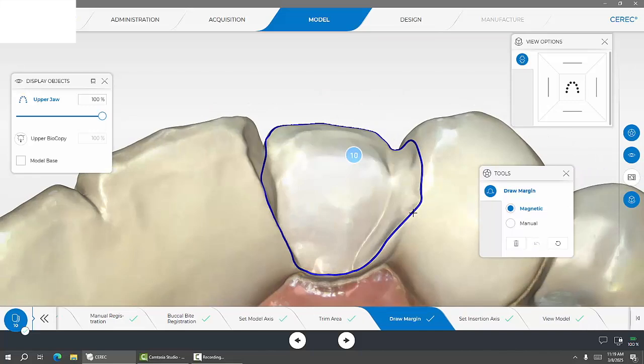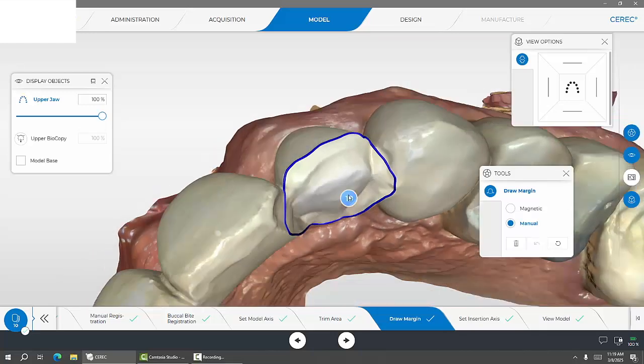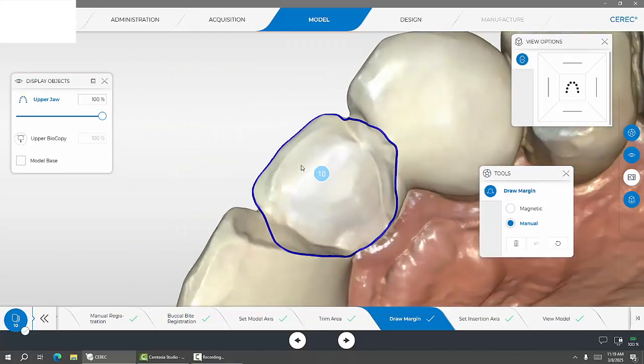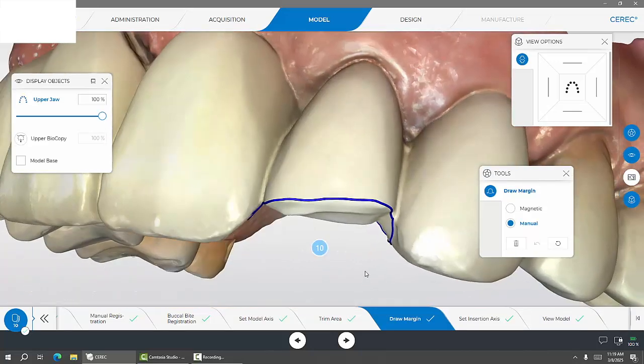Okay, so that's where I want to place my margins, and the reason why I'm not carrying it forward all the way to the incisal edges of the neighboring teeth is because then I will have a lot of proposal in that area, and I'll get bulky embrasures, so it'll be a little more technically difficult for me to fine-tune my embrasures. So I like where I am right now. And that's pretty much what my margination is going to be. You can kind of see where all the porcelain has fractured off. That's pretty much what you want to marginate.